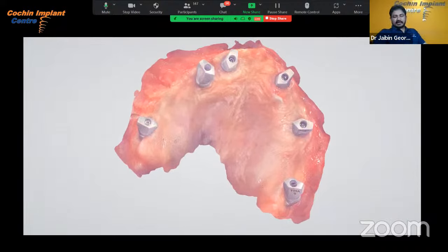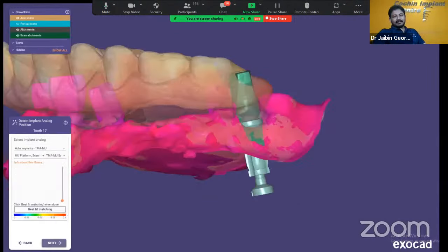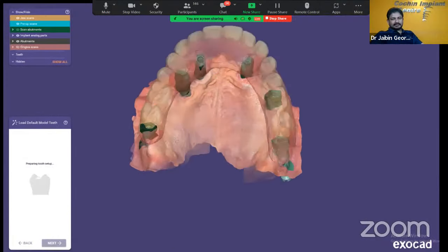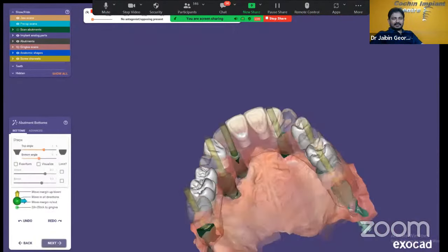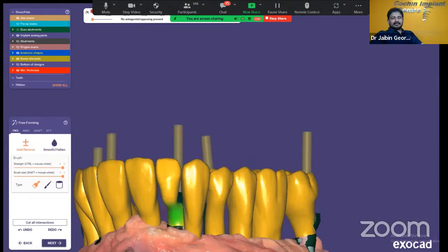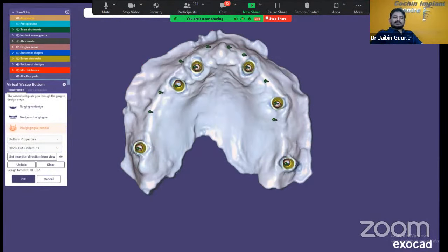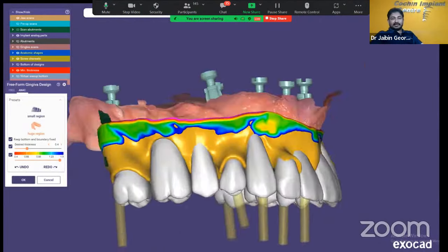This is the scan with the scan bodies. And this is the lab work, what they do in the lab, full digital protocol. I just play this so that you can see what all work they do there in the lab. So this is how they make the prosthesis fully digital in the lab.